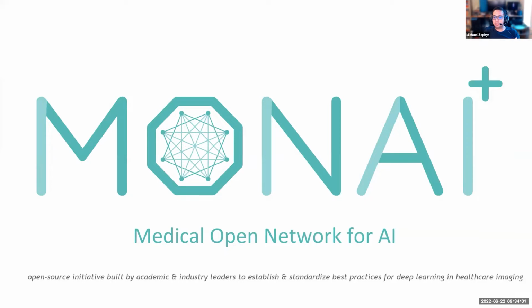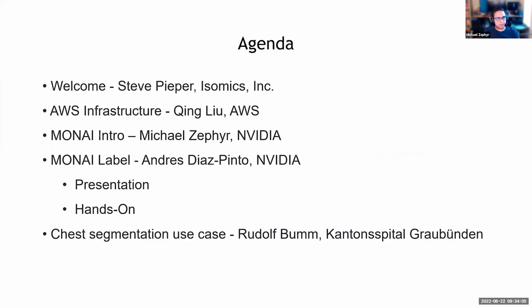So MONAI stands for the Medical Open Network for AI. For the agenda today, you've already seen 2 of the speakers. Steve gave us a welcome introduction. Qing talked about the AWS infrastructure, and I'm going to talk a little bit about MONAI as a whole. Then we're going to hand it off to Andres for MONAI Label and Rudolf for the chest segmentation use case.